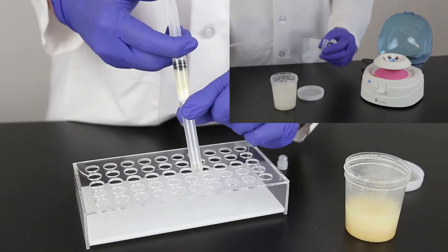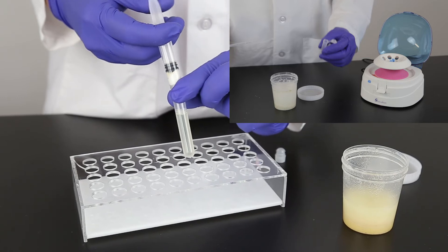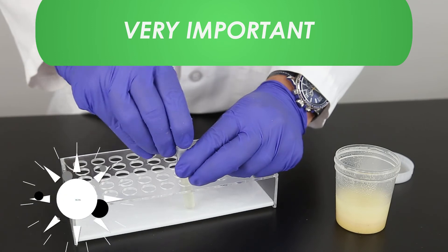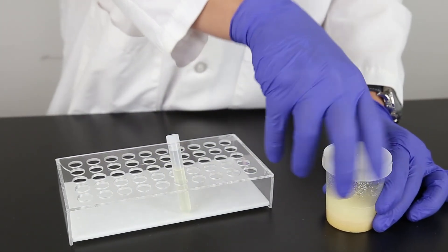You can also pipet the sample into a 2 milliliter microcentrifuge tube and centrifuge for 30 seconds. It is important to collect at least 3 milliliters of filtrate through a single filter syringe for optimal sample accuracy.